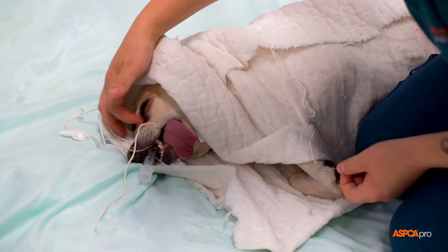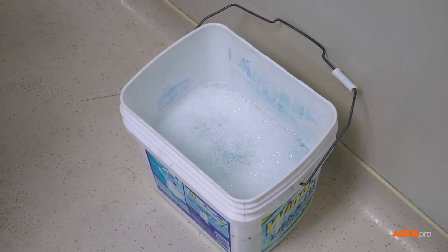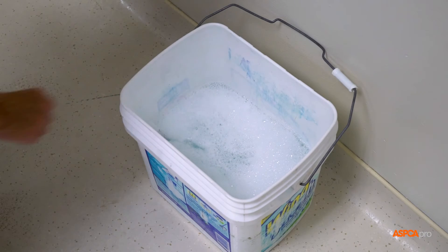As patients are extubated, place their used endotracheal tubes in the soapy water recovery bucket to soak until there is time to clean all of them together.